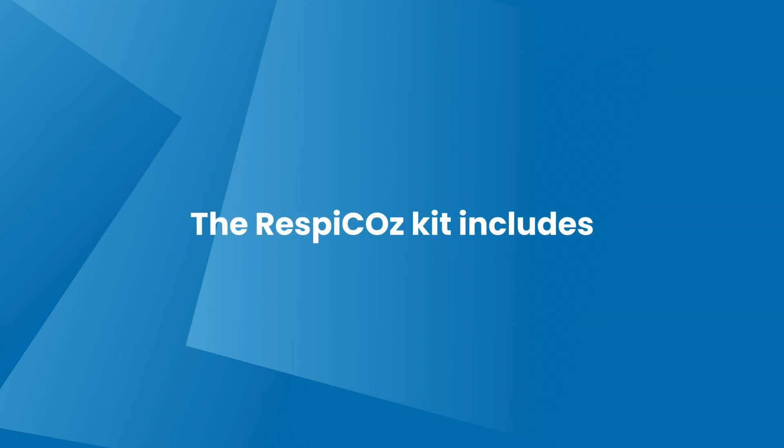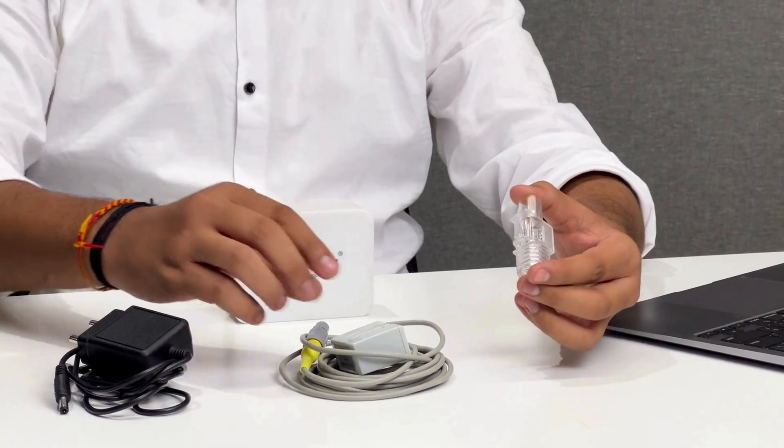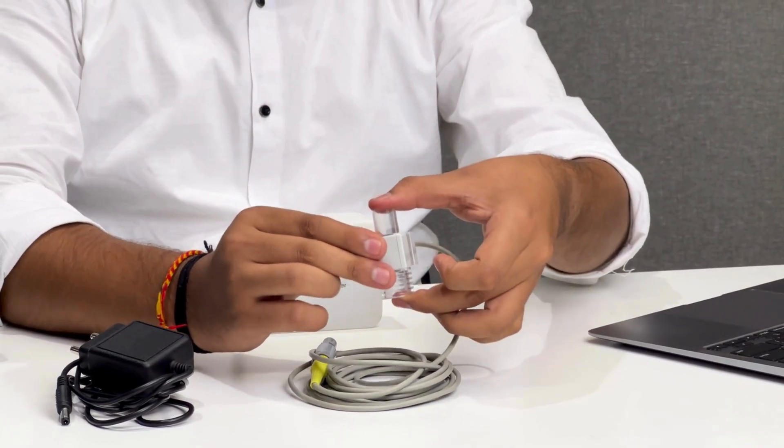The RespiCOz kit includes the main device, a sensor, an airway adapter, and a power adapter. This is the airway adapter and the sensor. Now connect the airway adapter to the sensor as shown. Make sure it is properly connected.